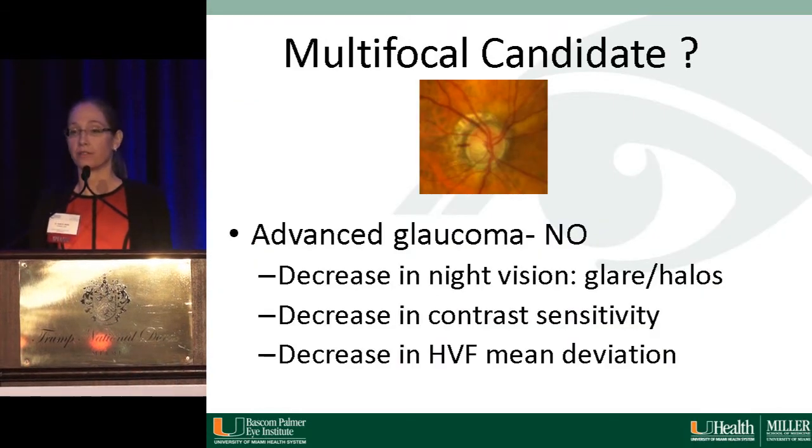So let's talk about multifocal IOLs in glaucoma patients. There's a lot of debate over whether or not these are good for our glaucoma patients. I think we could probably agree that in very advanced glaucoma, it's not a good idea, mostly because we know that there's some decrease in contrast sensitivity. And there have been a few studies that show patients have a decrease in their mean deviation on their Humphrey visual fields after multifocal IOLs.